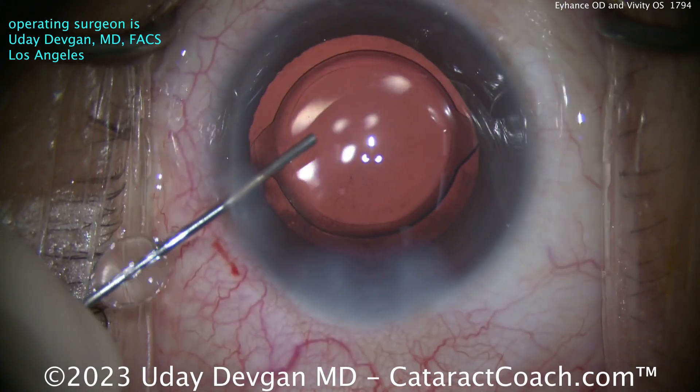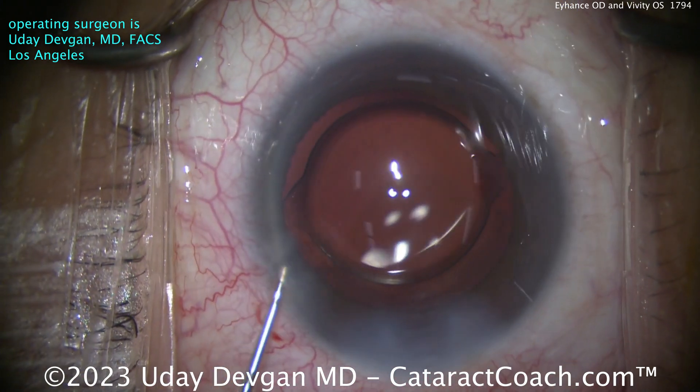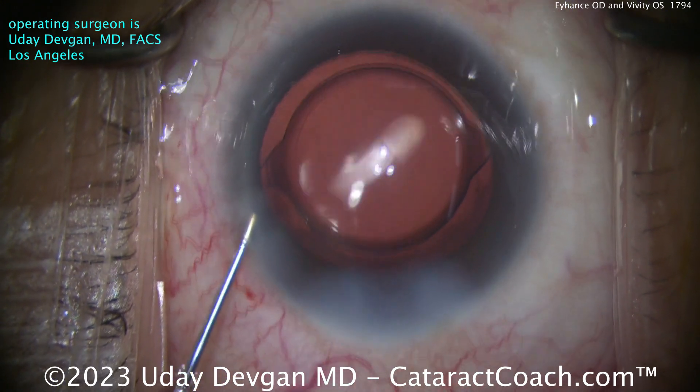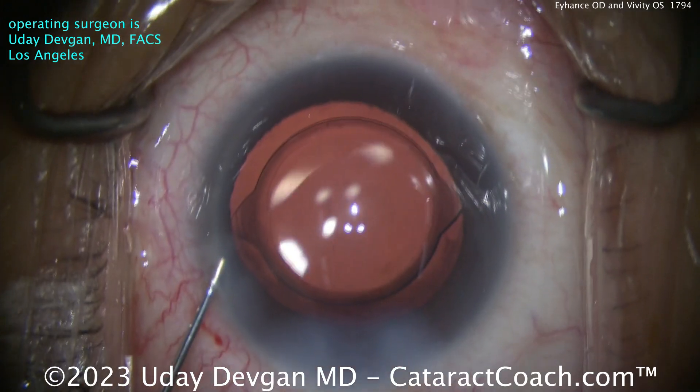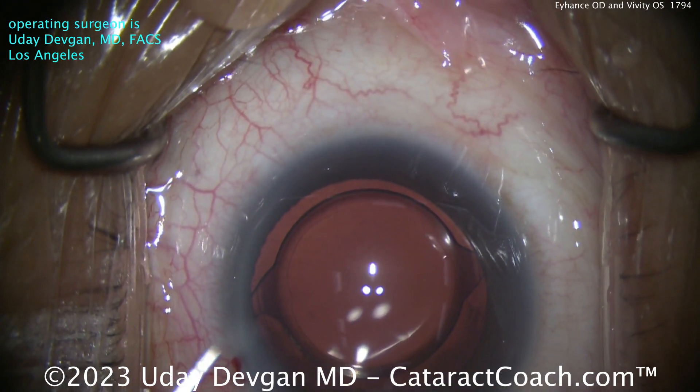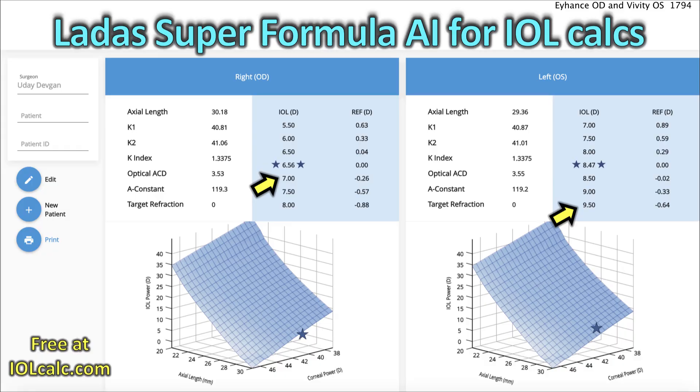The patient is a very highly myopic patient — a physician who flew on an airplane to come see me here in Los Angeles in Beverly Hills to have surgery. Let me go over the lens calculations. Looking at the right eye, a 7.0 diopter lens is going to be the best option for best distance vision. Don't put in the six and a half — a minus a quarter outcome is better than plano, especially for this patient.